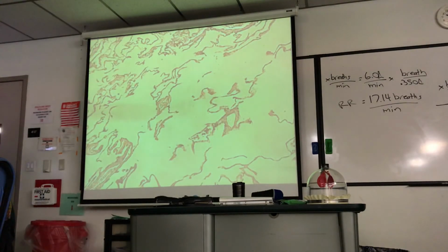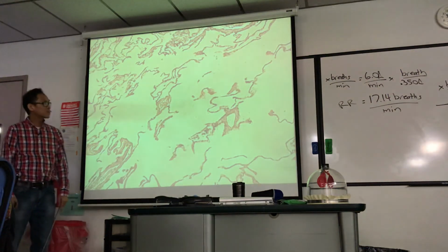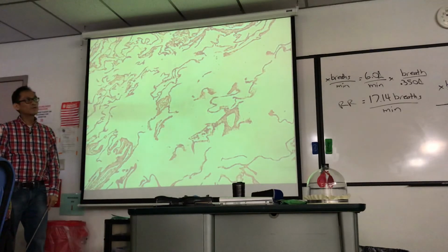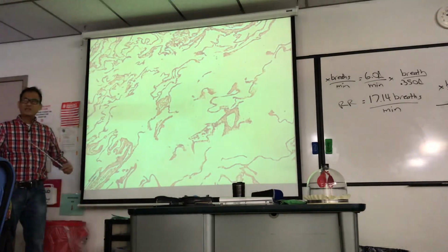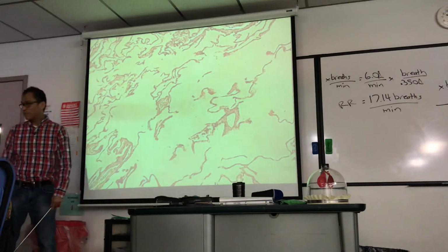This is a higher mag of emphysema lung, fewer, larger alveoli. What it does is, for example, like the cigarette smoke, it destroys the elastic fibers of the alveolar structures. So it's really easy to inflate the lung, but it's really hard to empty the lung. So a lot of air gets trapped in the lung in emphysema. It's a problem for them.